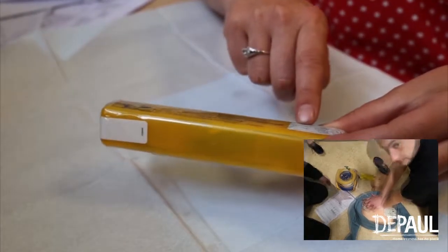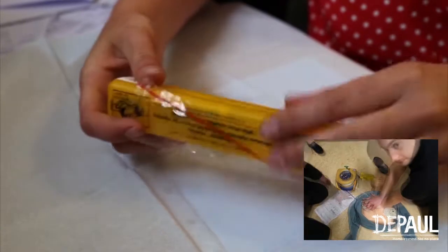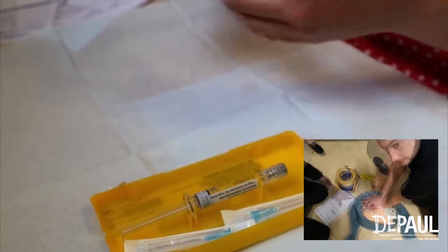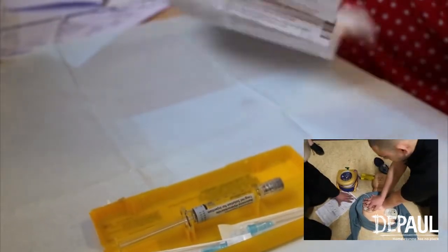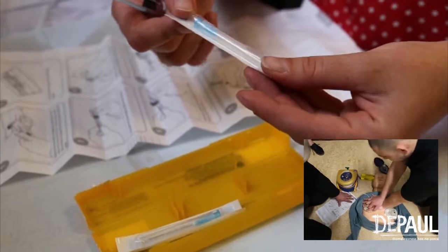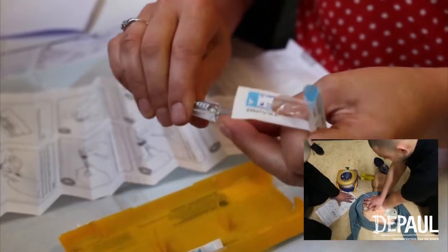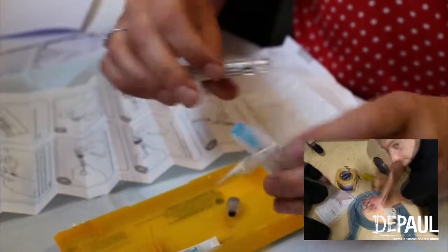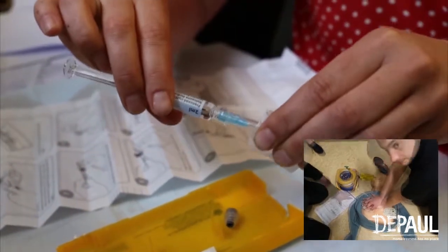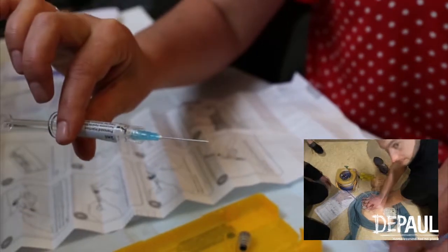To use naloxone, check the expiration date. Remove the clear film wrapping by twisting the outer plastic box as shown and removing the seal. Open the box which contains one syringe of naloxone and two needles. Remove the instructions and place them beside you. Check that the needle's seal isn't broken and open the needle by pushing the blue top through the paper backing.